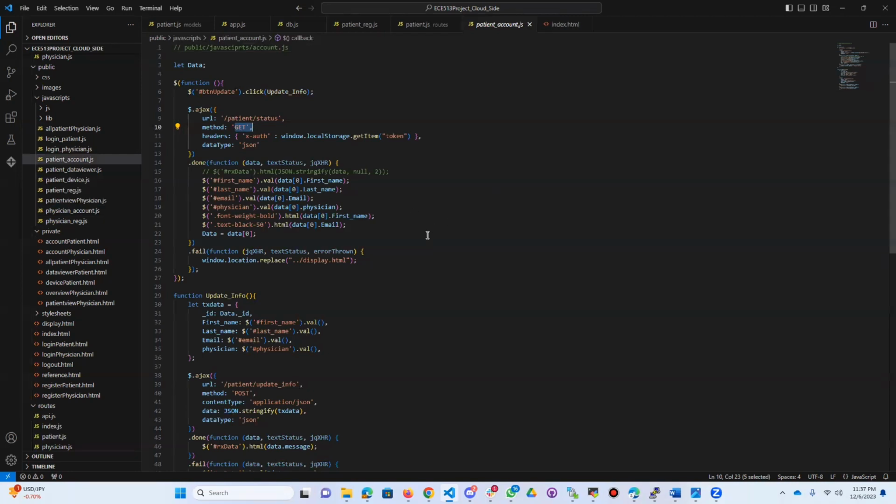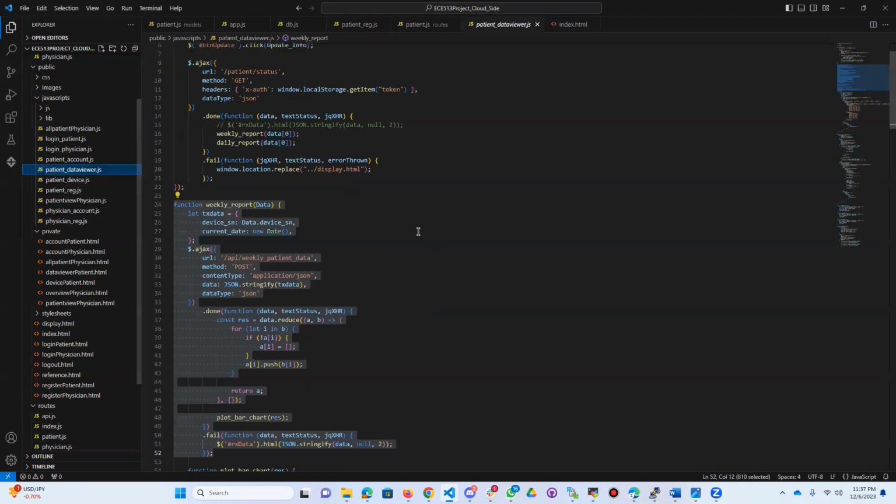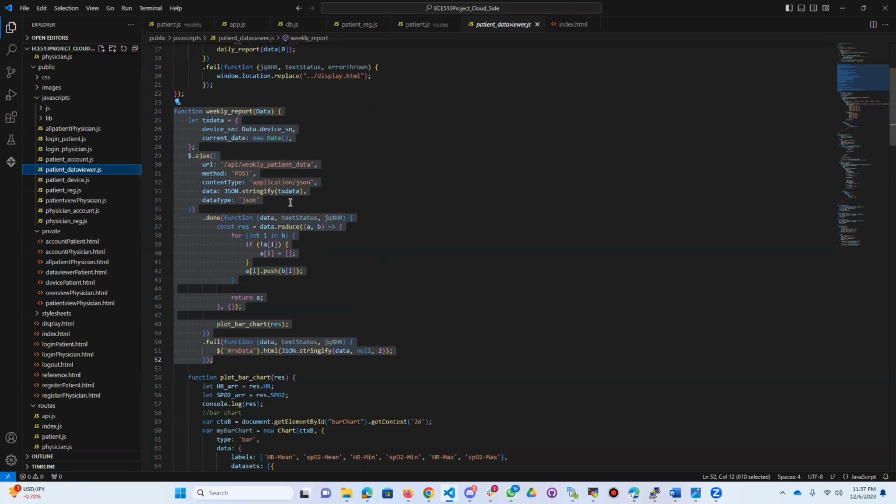And if we move to the patient data viewer JS, here you can see the weekly report function, which fetches the weekly patient data using Ajax. It organizes the data for the bar chart plotting and dynamically creates a bar chart using Chart.js. The chart displays the mean, min, and max values of the heart rate and oxygen saturation level.